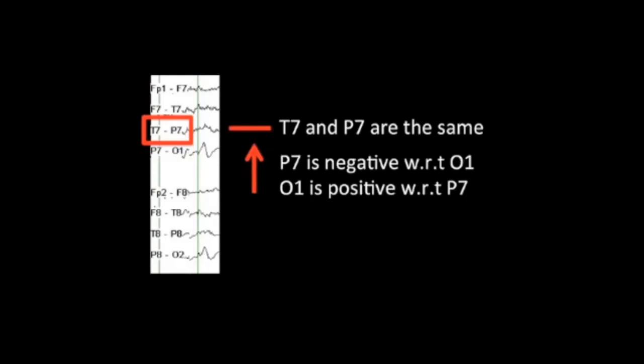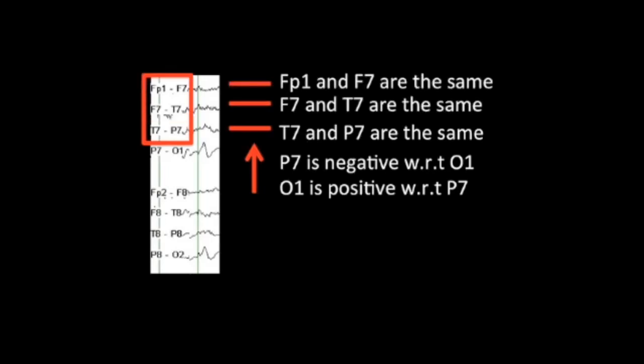We can see that actually, at T7P7, the line is relatively flat or isoelectric. By EEG convention, this suggests that T7 and P7 are the same. Further up, we see that all the other channels are flat as well, suggesting that all of these electrodes have similar or the same waveform. Therefore, the electrode that seems to have different activity is O1, and this suggests that we have a positivity at O1, or in the occipital region.